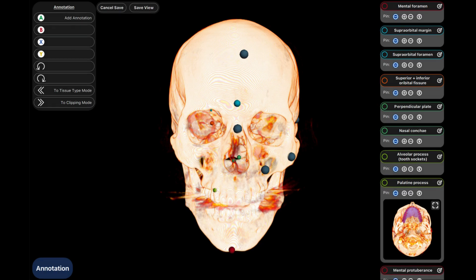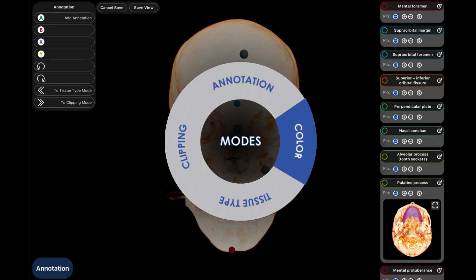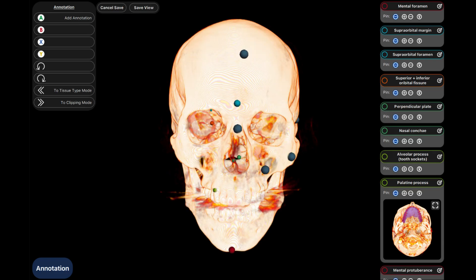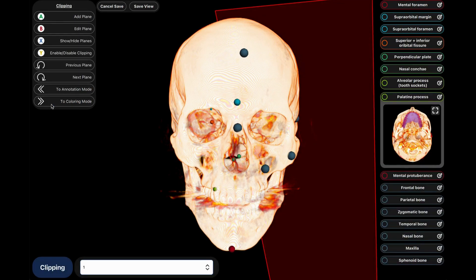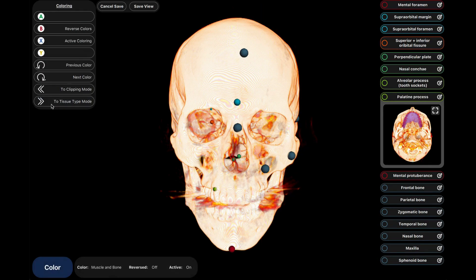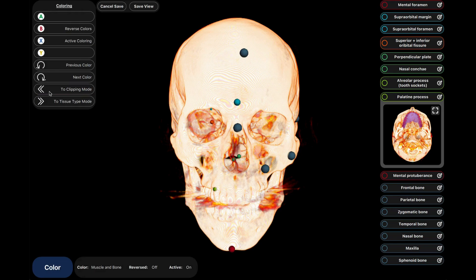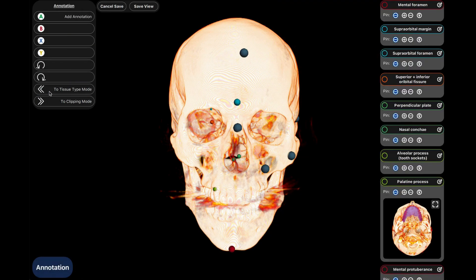The BodyViz modes are set up in a cyclic or circular design, meaning you can't get lost in BodyViz — just keep cycling through the modes until you arrive at the one you need. To change modes, simply click on the double arrow buttons in the control panel menu. There's a button that will advance you forward and a button that will take you to the previous mode. There will always be a label on the button telling you which mode you will be cycling to.